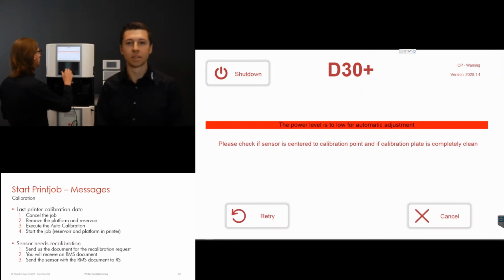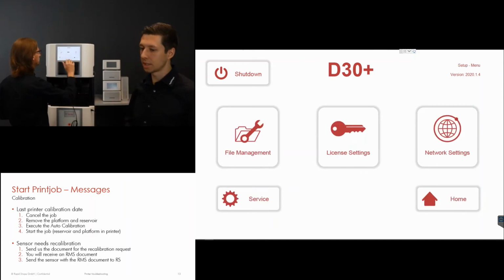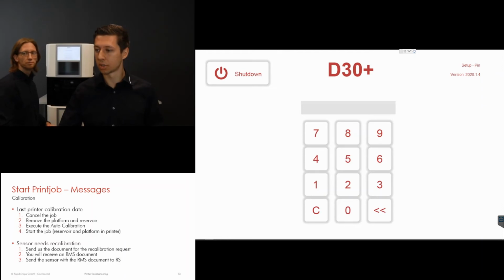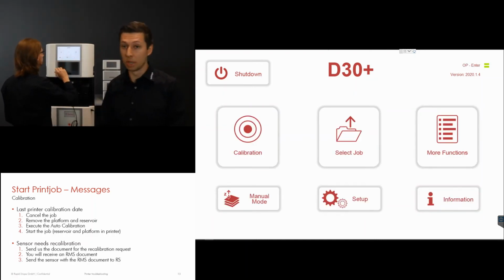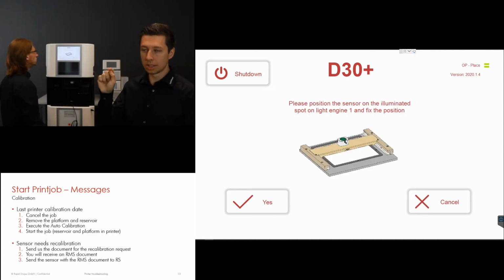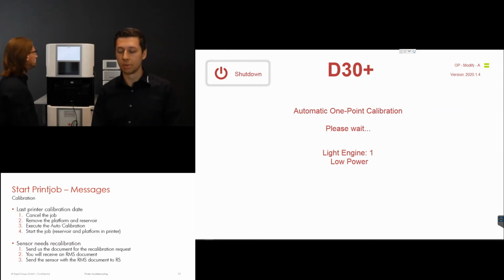Good, as already mentioned. Now if you recall what we have to do, going into the setup, logging in with a certain level. So we just use now, for example, the distributor one. You will get the password if you contact us directly, for example. And now Robert is going back to the main menu and getting into the calibration. Remember, top right, you can see still logged in as second level. So now we just execute the calibration.